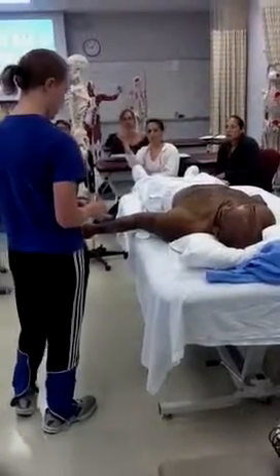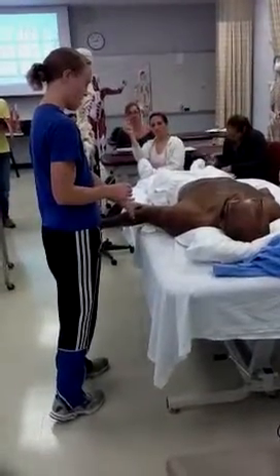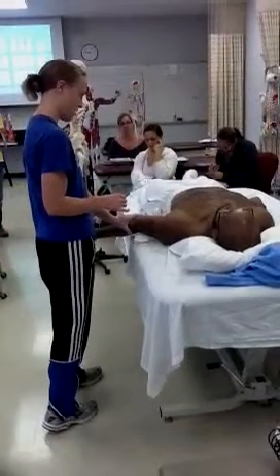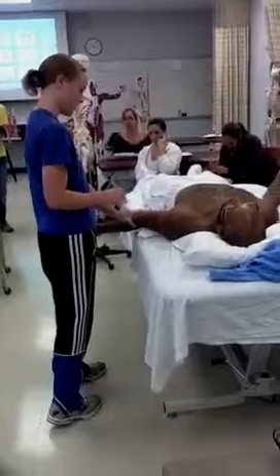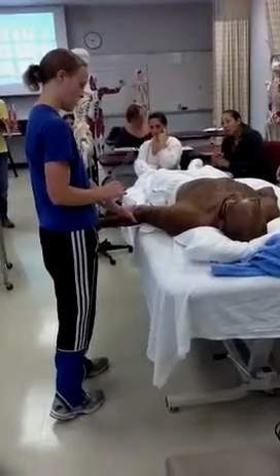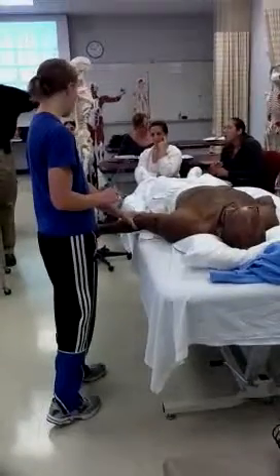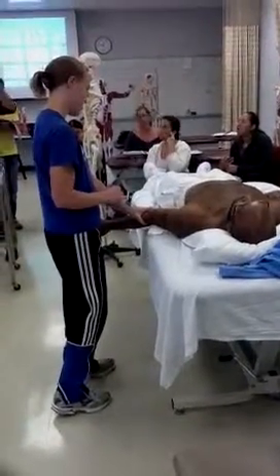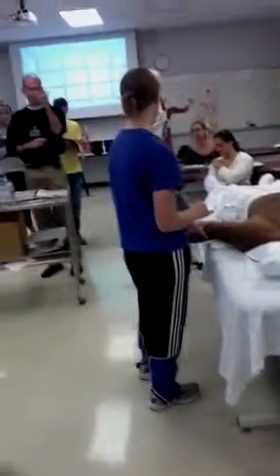Patty, what will we line up the proximal arm — the non-moving arm of the goniometer — with? On the lateral midline of the humerus or the arm. And then you have a bony landmark to help you do that, which is the acromion process. Can you palpate that on the skeleton, please?